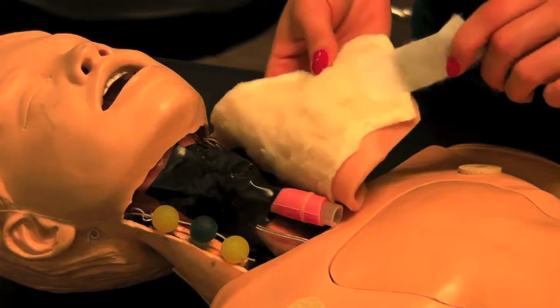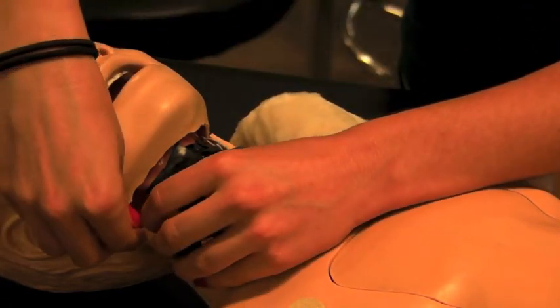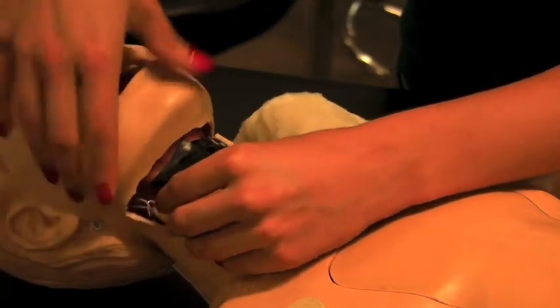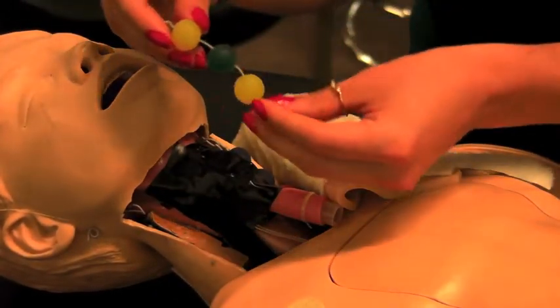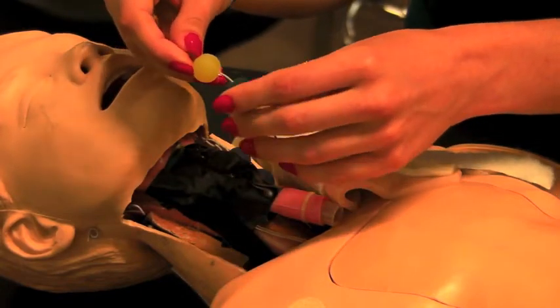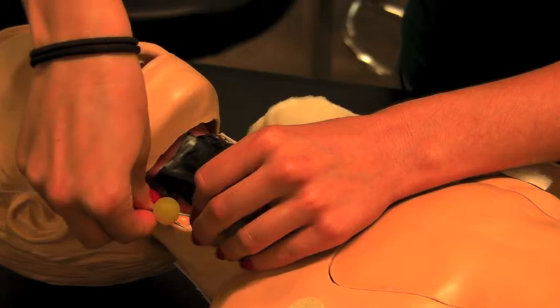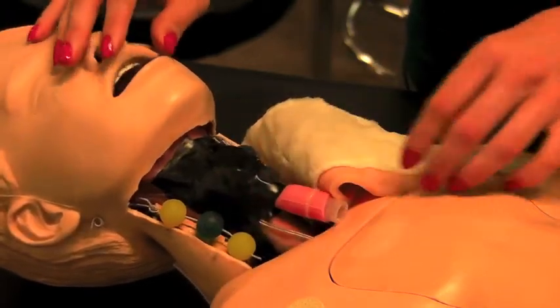The neck skin is easily removable with velcro pieces, and the lymph nodes are manually interchangeable. You can just hook them onto a wire, and the lymph nodes themselves are also interchangeable — you can put different sizes on to simulate enlarged lymph nodes.